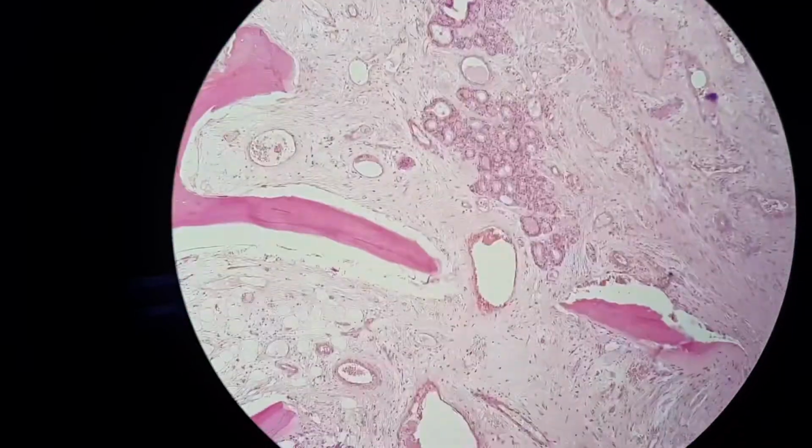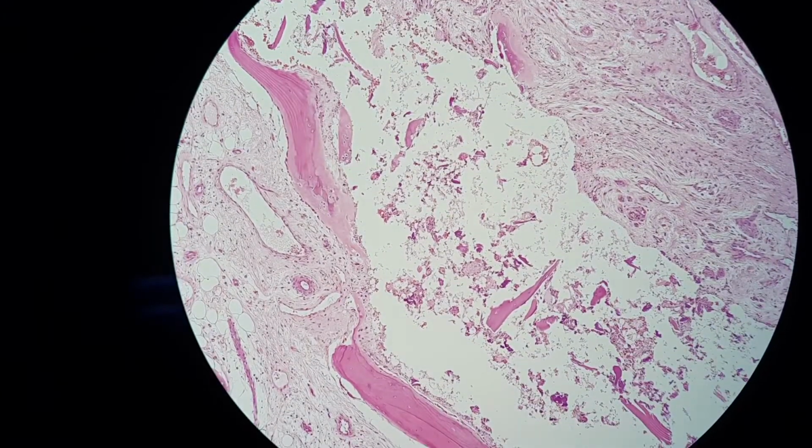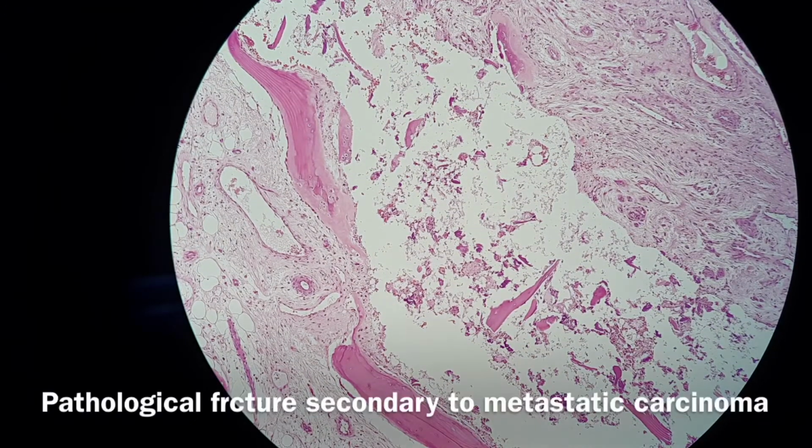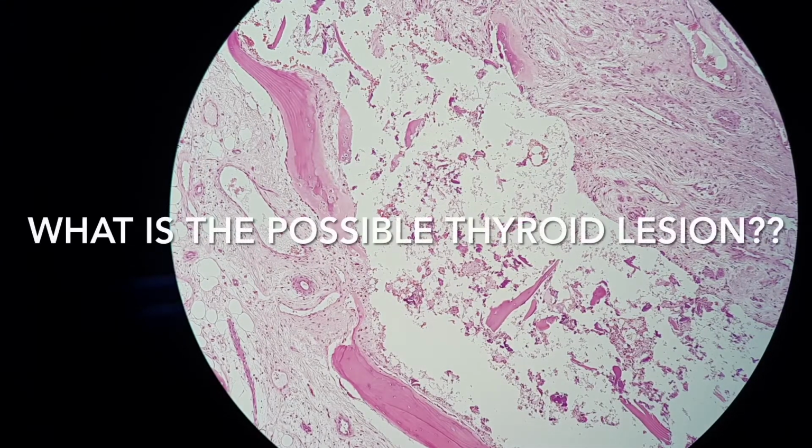And if you see the broken bones over here, broken and also necrotic bony trabeculae, it signifies there are some fractures going on. So most probably the fracture is a pathological fracture due to the weakening of the bone structure because of the presence of the metastatic thyroid follicles here.